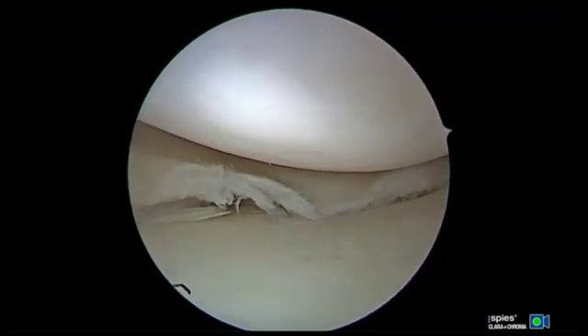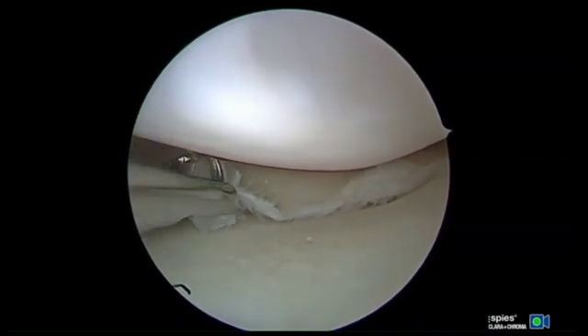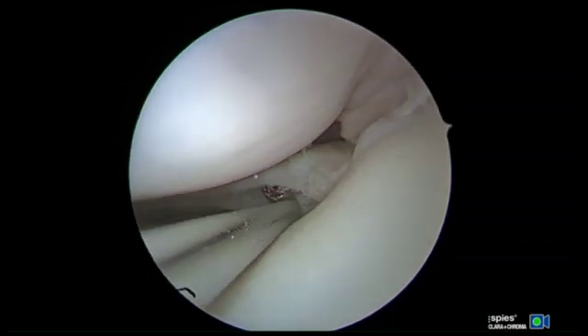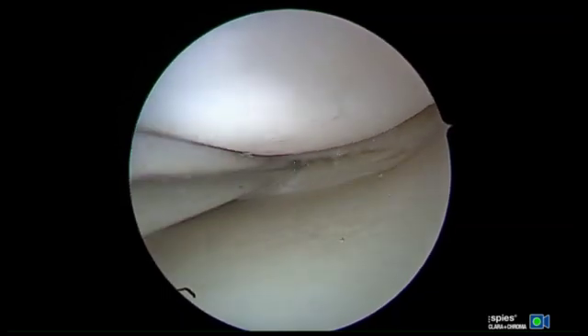The frayed edges will then be debrided back to healthy tissue utilizing a combination of the arthroscopic shaver and biter to prepare the edges for further repair. An arthroscopic rasp will then be introduced to stimulate bleeding from the meniscus and adjacent capsule to aid in the delivery of healing factors to potentiate the healing.